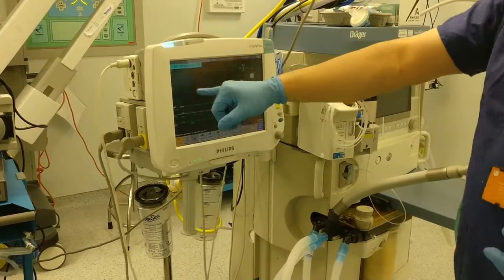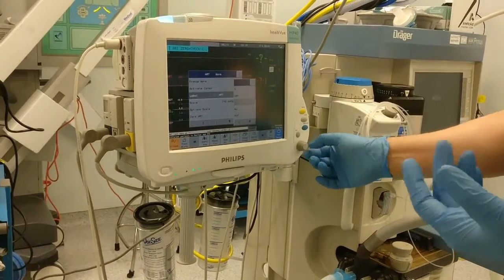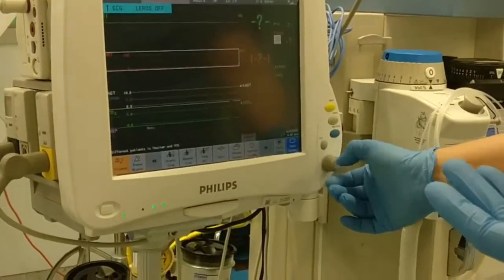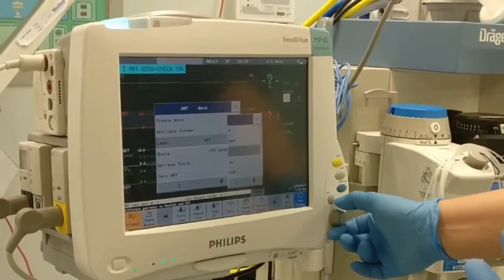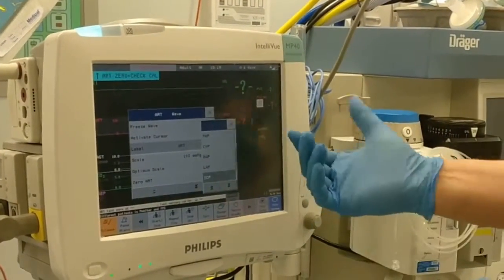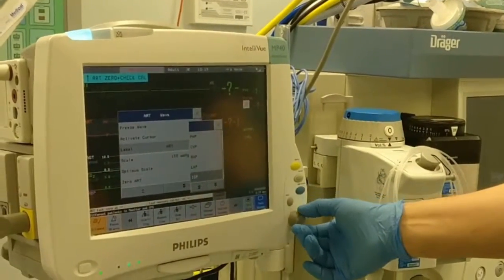The anaesthetic machine is then set to monitor for central venous pressure by changing the pressure settings. This allows the next step to be performed, which is the zeroing of the system. To select the CVP setting, scroll to the area on the monitor that deals with pressure and then down to Label. Change this setting from arterial to CVP. This gives suitable pressure ranges for dealing with compartment pressure. It is possible using this screen to set up an alarm above which a pressure would alert the clinician, and this could be useful in continuous monitoring.